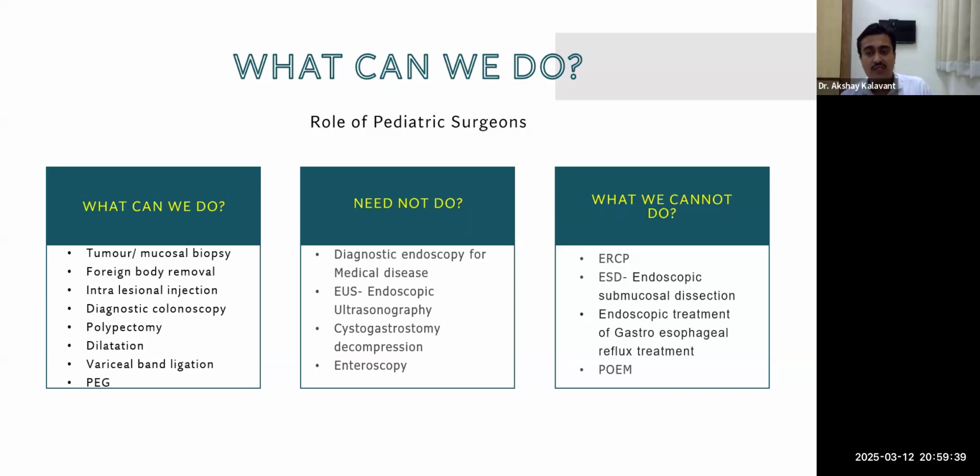So first I put over here is ERCP. Now, the indication for ERCP is very less in pediatric patients. So we do get patients for ERCP, especially little older children, 9, 10, 12 years old, with chronic pancreatitis. Yes, of course, they do require it, but the numbers are very low. And in certain places in India, there is a very high chance of pancreatic diseases. So maybe there they might get it, but otherwise the need for ERCP is very, very less.